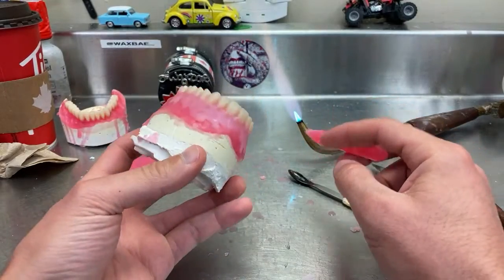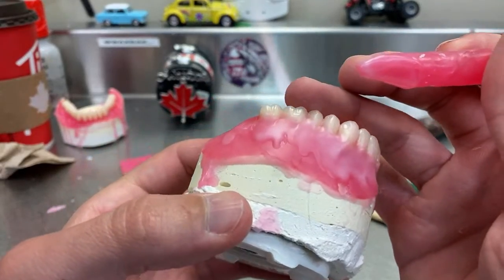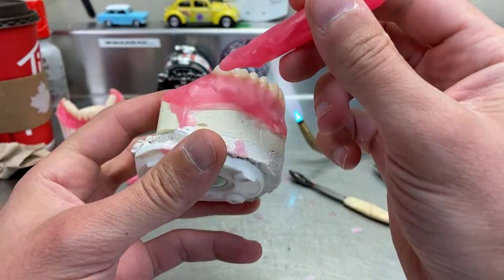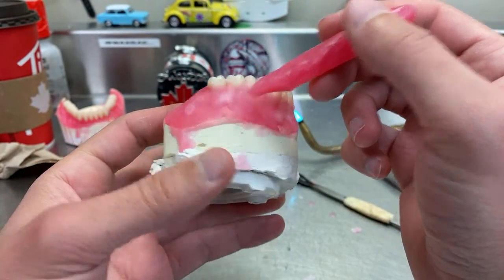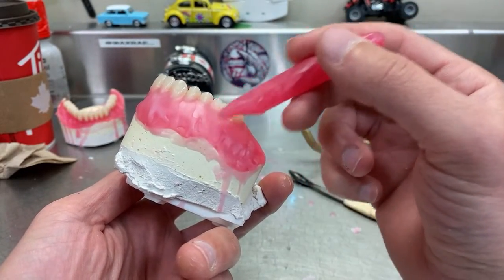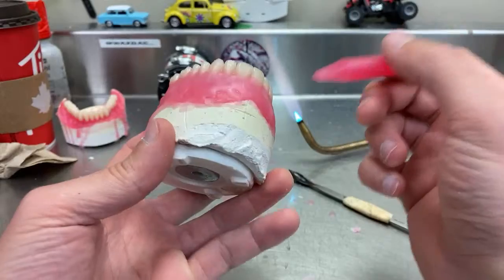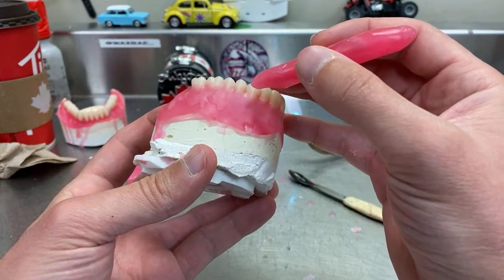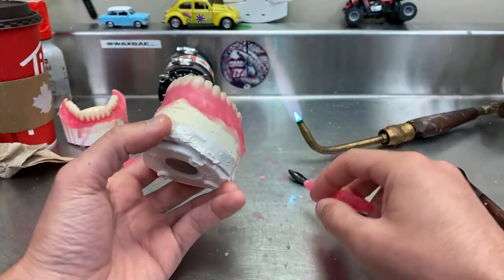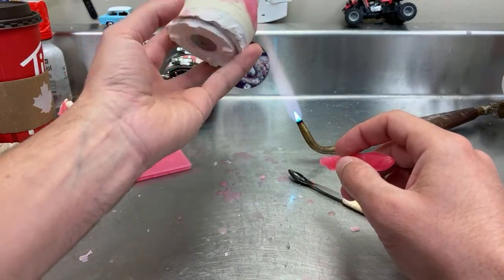So what I'm targeting here is adding the wax. Don't cover the teeth because they will look ugly and covered in wax. Try to keep them clean as much as possible. And what I'm trying to do is adding the wax to mimic the gingival rolls. And that's by adding it just around here, here, here. Don't get the interproximals too thick. You need wax in them, of course, so they don't create food traps, but you need the wax to not always flow in there when you're adding. So that's another thing.